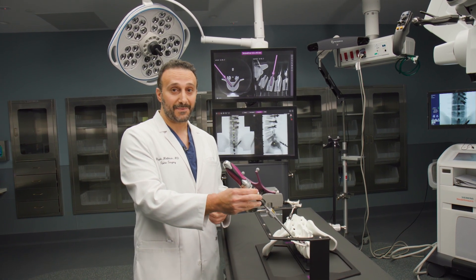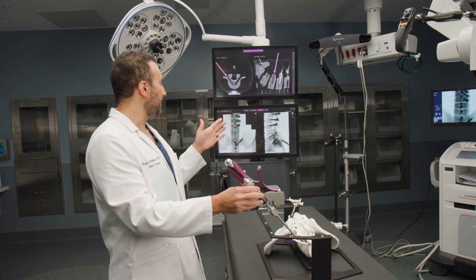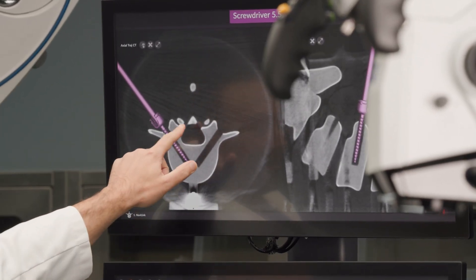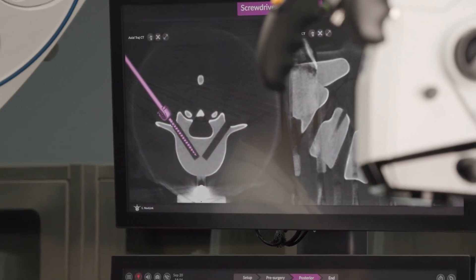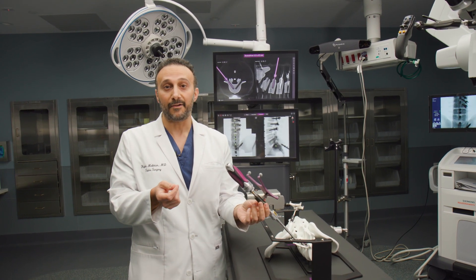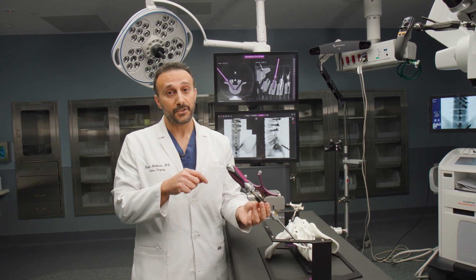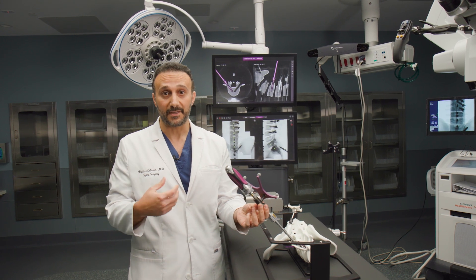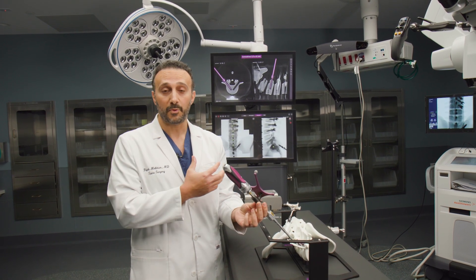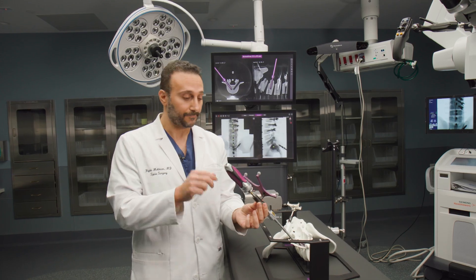The reason that's important is because when we're placing these screws, as you can see, this area right here is where the nerves live. So if that screw thread comes through that area and into that nerve canal, those patients will have to come back to have that revised because it will give them leg pain. So this will lead to less and less revision surgeries.